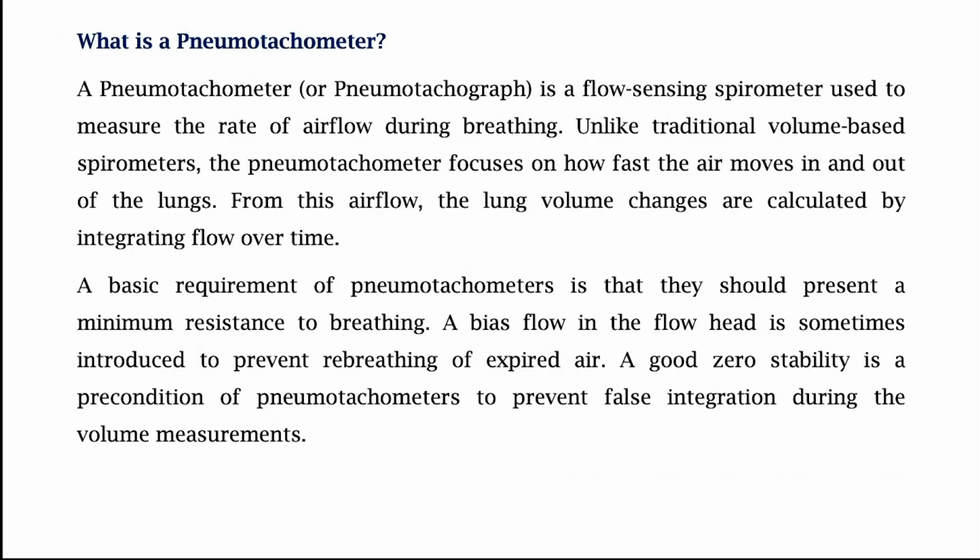Essentially, the resistance will increase. What will this do to the flow itself? That is the question. So essentially, the pressure difference will be created that causes changes in the flow rate, and a similar situation happens in the airflow case, that creates measurable changes in pressure.